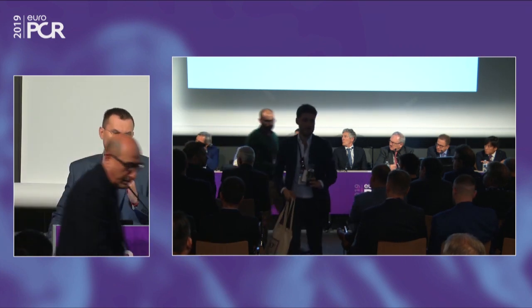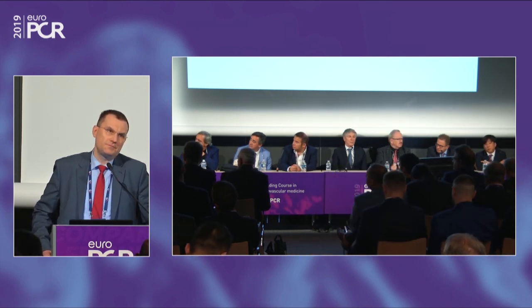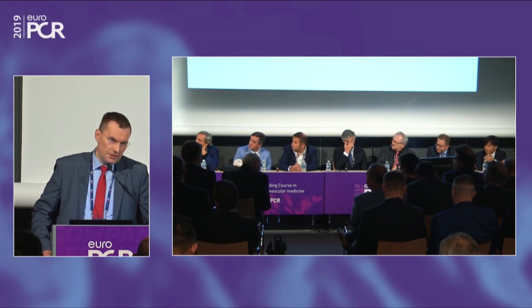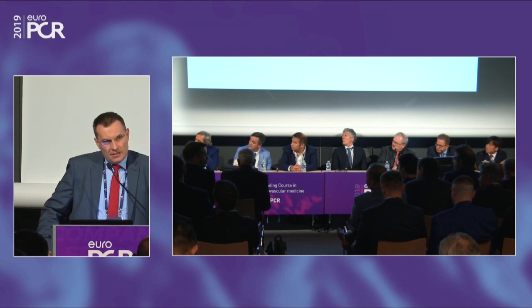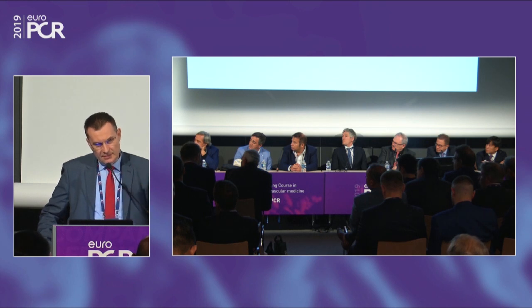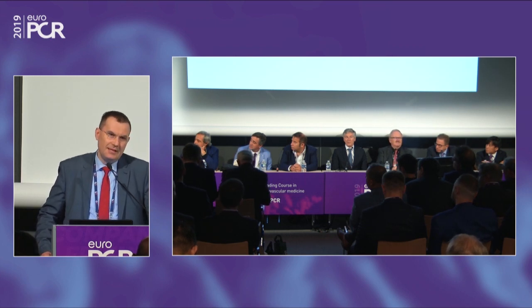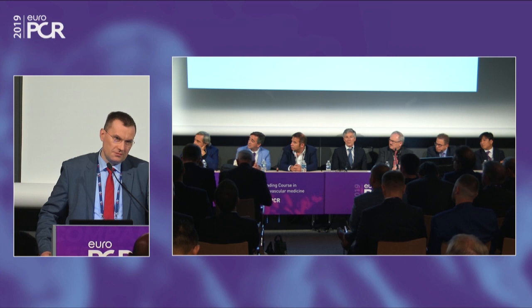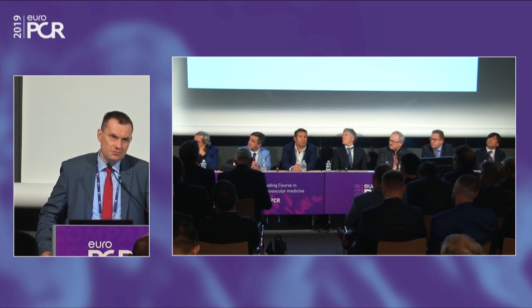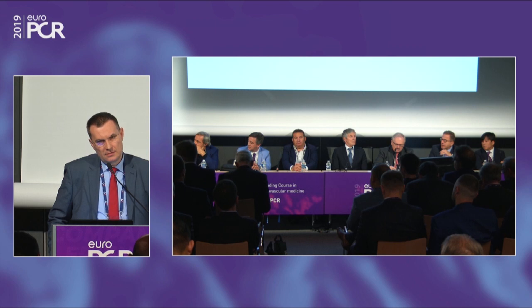For me, no. To be honest, with BiOSS only, we have maybe 5 or 6 cases with 2 BiOSS. But I have quite a good number with culotte stenting using BiOSS for the side branch and a regular stent for the main branch. This is some kind of hybrid culotte stenting. And in general, I use BiOSS exactly for this reason, because of the angulation. And because with BiOSS you can choose the proper size and not be afraid of malapposition proximally, as when you use the regular stent.